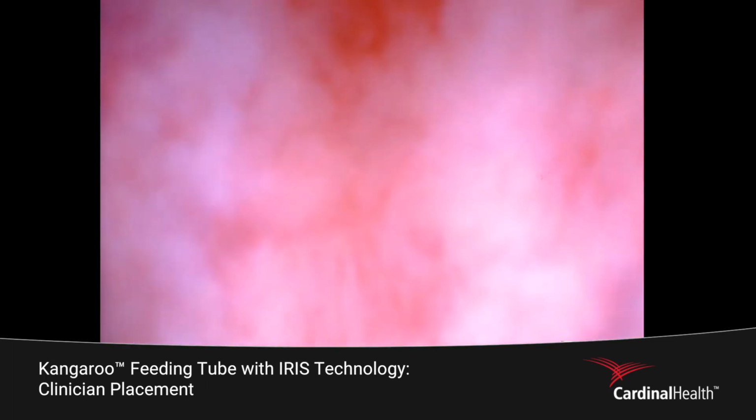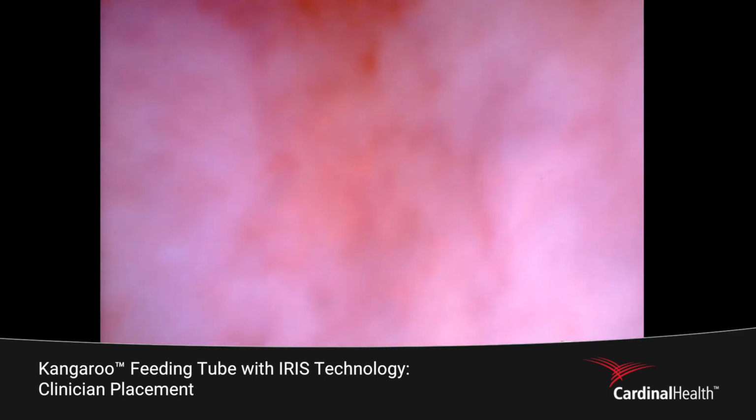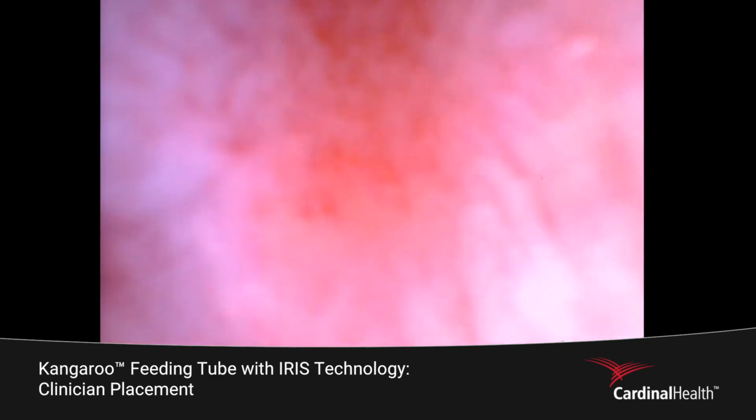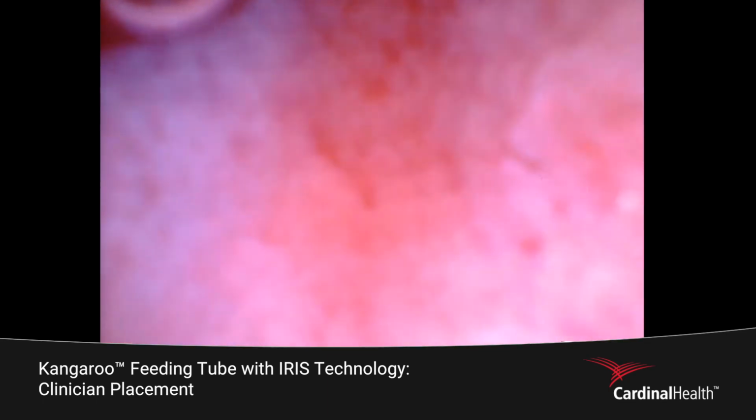There. And that's how there's a quick drop that it makes into the small intestine. And there, great shots right there of your villi, of your small intestine.